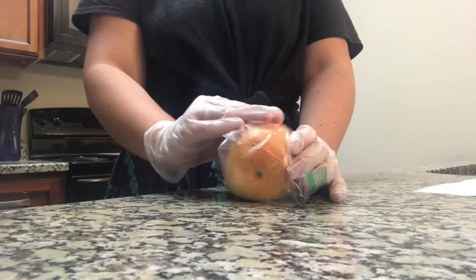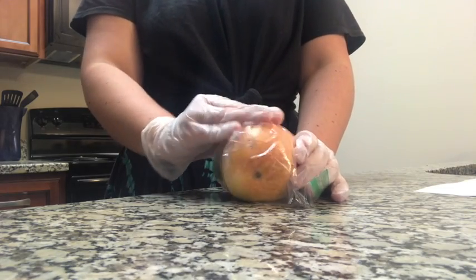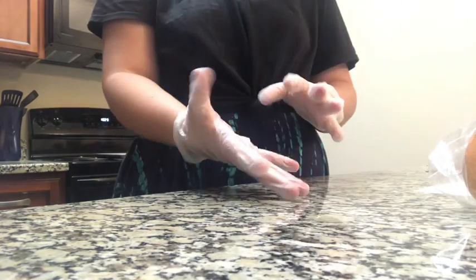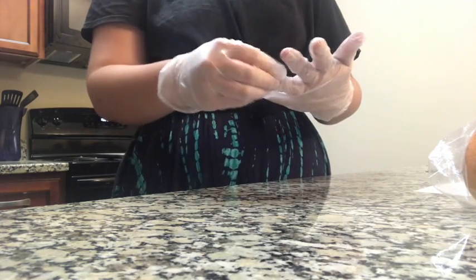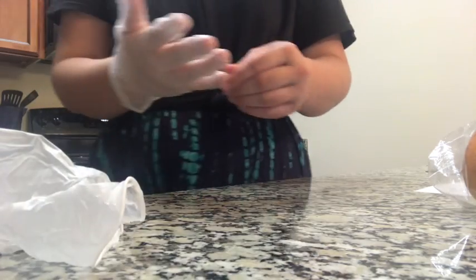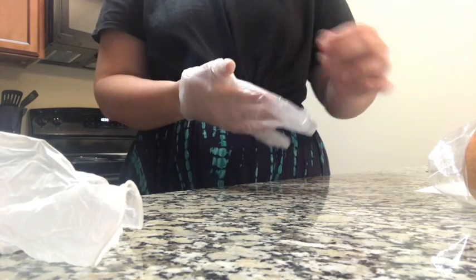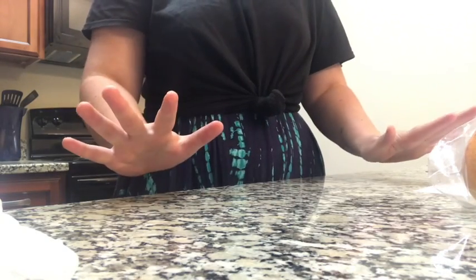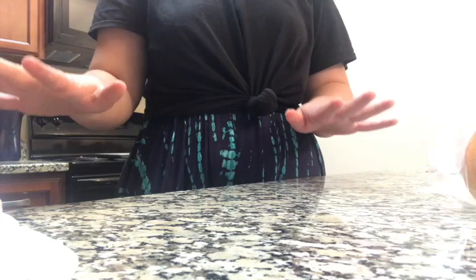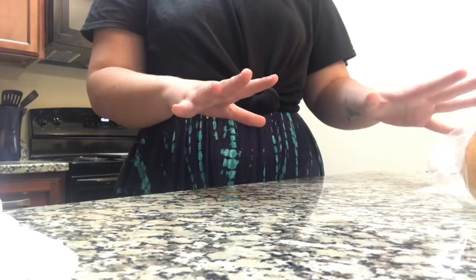I massage the area. I will assess my patient, make sure that he is okay. Are you comfortable? Do you need anything? No. I will remove my gloves. Not like this, but I had to reuse them. Wash my hands. I would document everything as soon as I get done. I will keep monitoring my patient for any adverse and side effects. And that is it. Thank you.